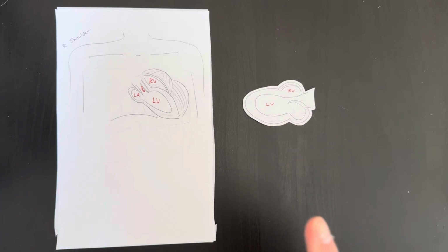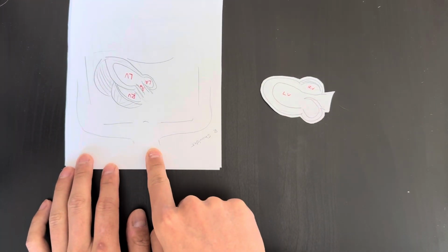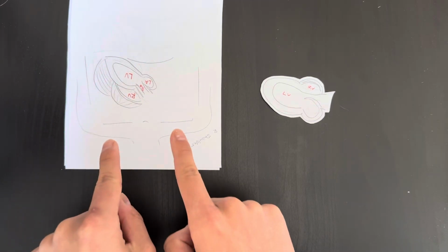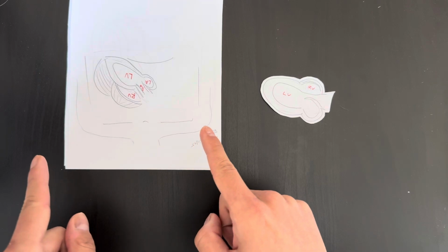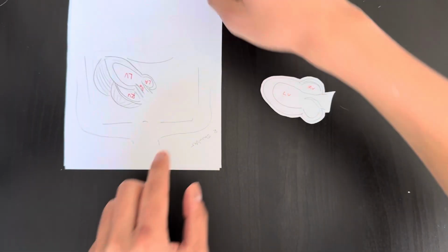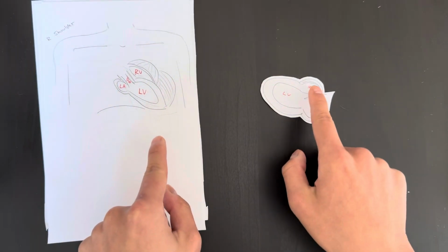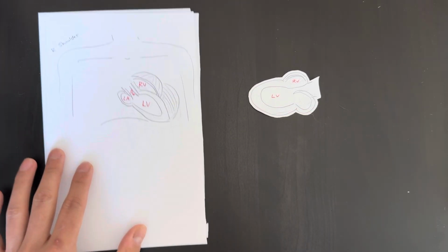And again, we're looking at patients kind of face to face. If you were, say, at the head of the bed, looking down on their feet, and let's say you were intubating them, or doing a central line, when you look at a patient this way, now their LV is technically on your left side. This is how traditionally the parasternal long was developed, but because we don't perform the parasternal long axis scanning at someone's head, we scan facing the same direction as them. This becomes very hard to cognitively think about, which makes it, in my opinion, kind of the hardest view to think about orientation. But let's work through this step by step, okay?